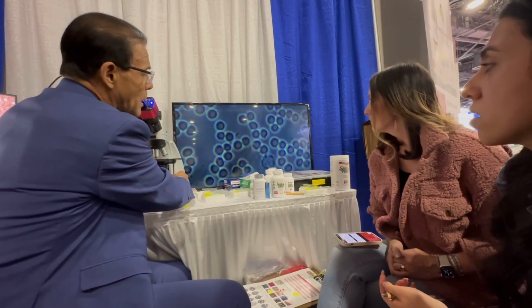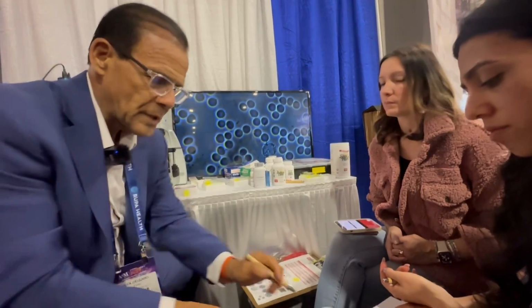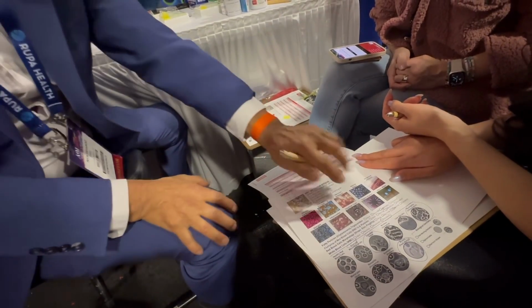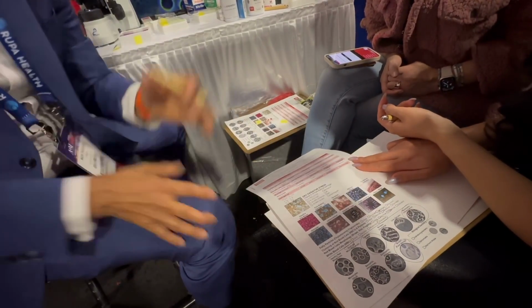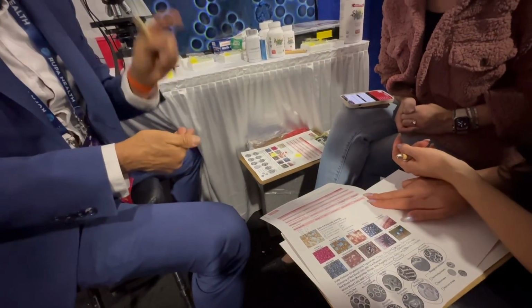Oh wow, so you've got a lot of white cells. You see that? Yeah, they're all over the place. All right, so that's elevated right here. See how we just look at the circles? We note what we observe on a scale of ideal, normal, moderate to elevated. Real simple. And then the digital form, I'm going to do the same thing. I'm going to click it off.